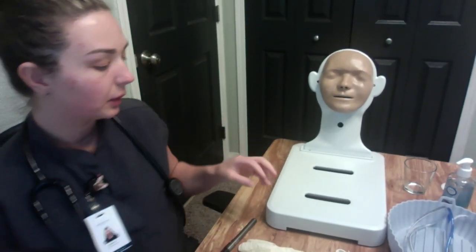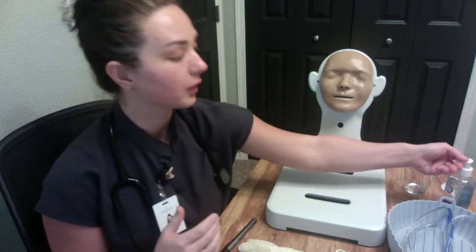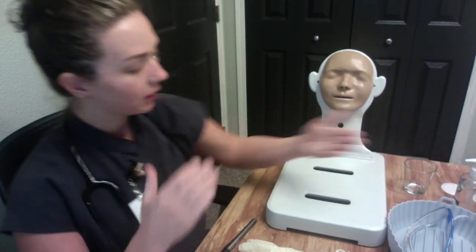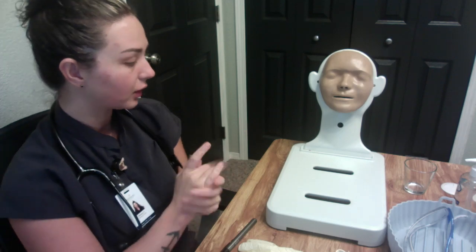So first things first, we would gather our supplies, enter the patient's room, knock on the door, and introduce ourselves to the patient. While doing this, we would want to perform our hand hygiene. Hi, Mrs. Smith. My name is Hunter. I will be your nurse today.